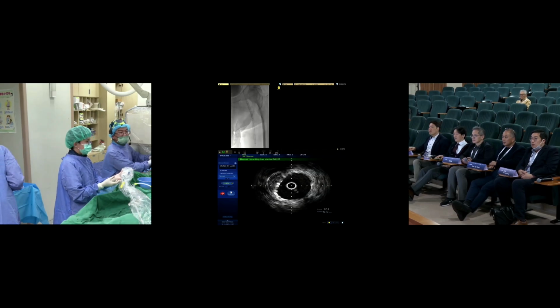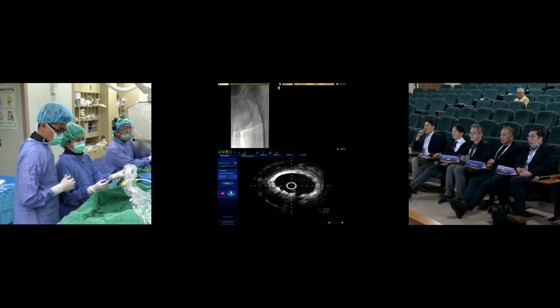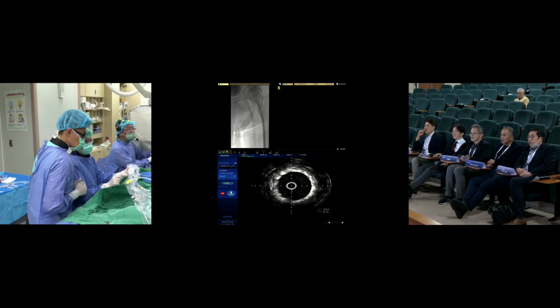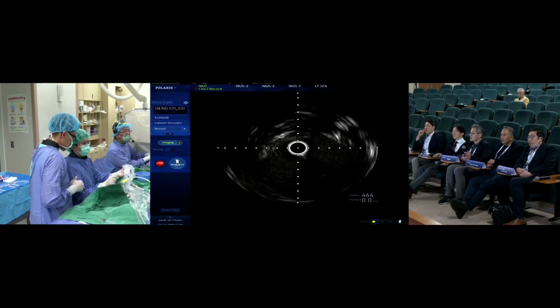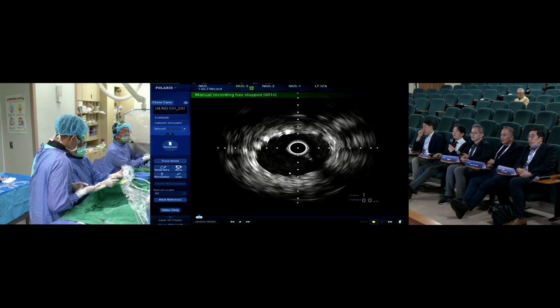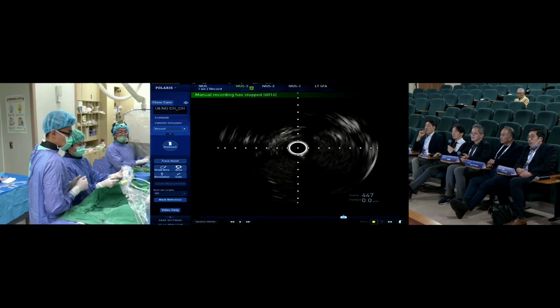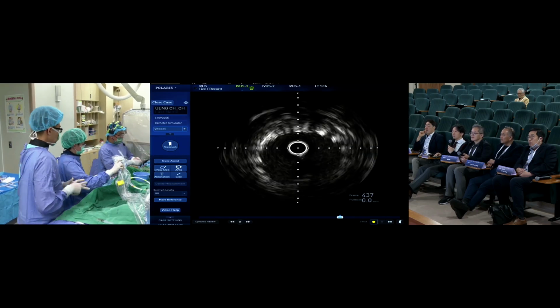We do 2 layers inside. Yeah, here. And enter. Is it looking good? Looks nice. Dr. Zong, looks nice. Yeah, that's better. Yeah, to cover the whole direction. All right.